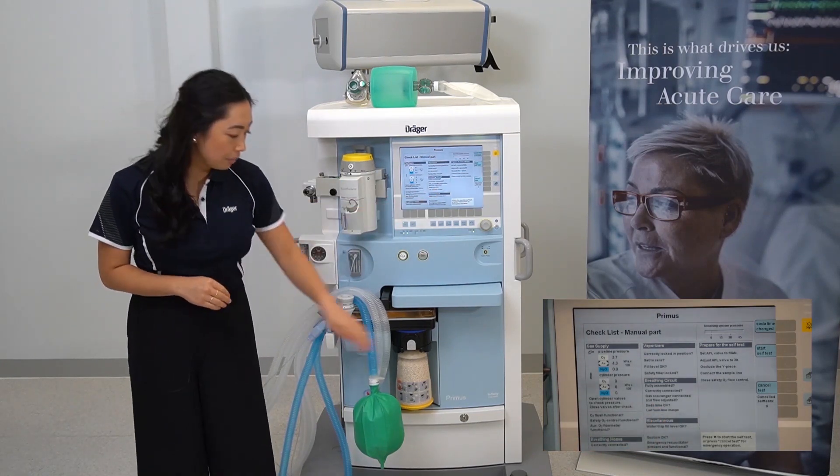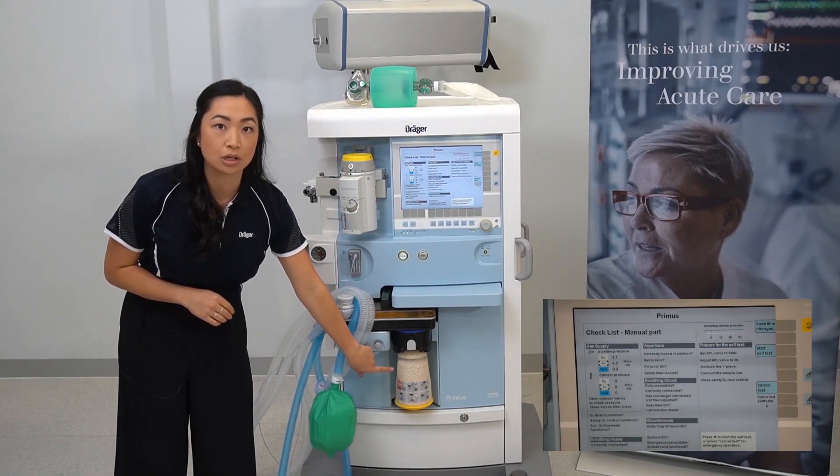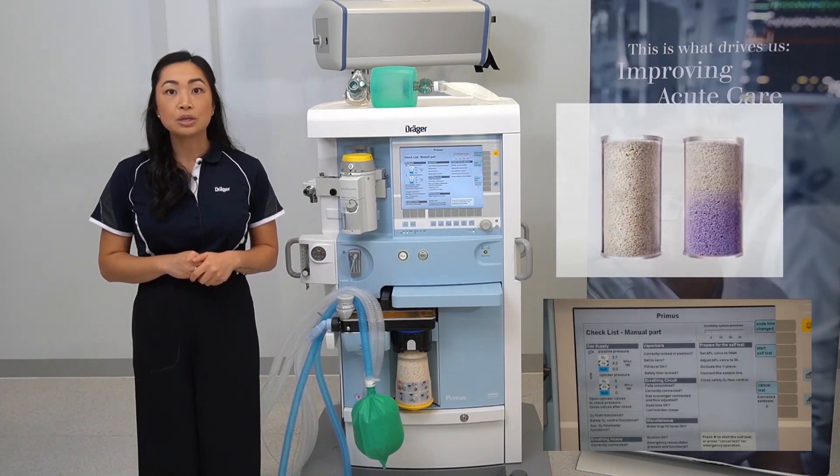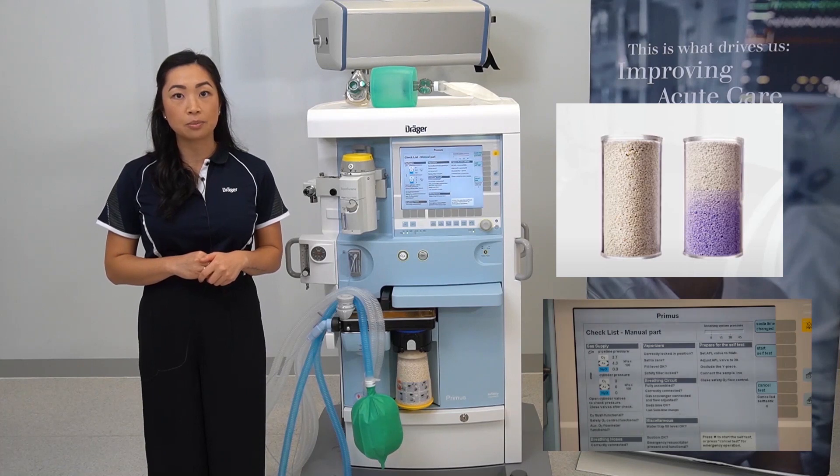To check your soda lime, visually inspect it — there should not be significant discoloration. Soda lime will change from white to purple when exhausted.